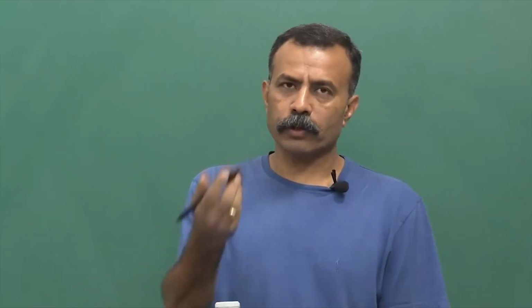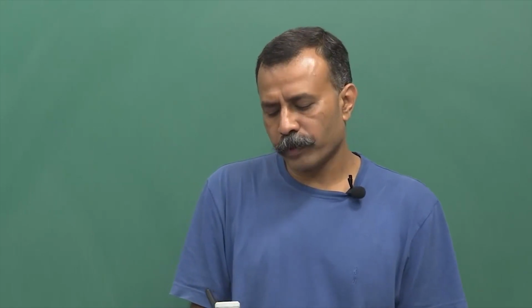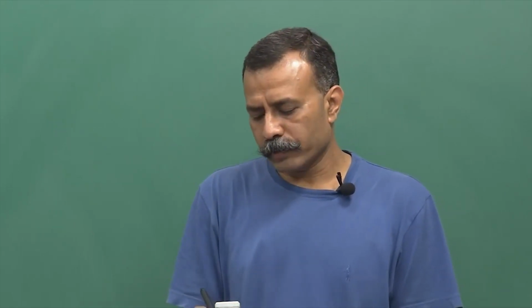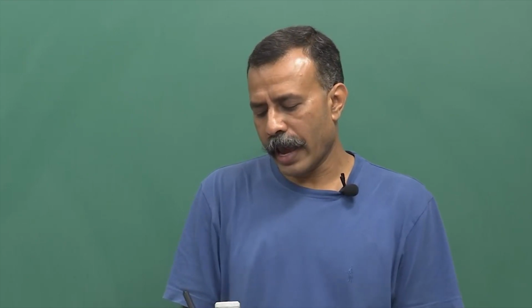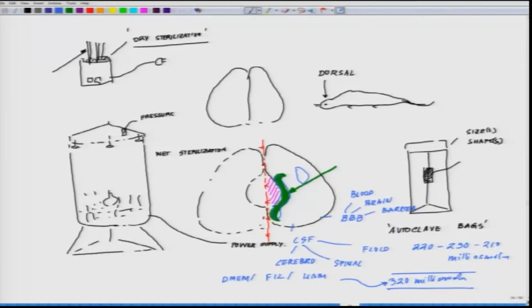For example, once we go to the media, you will realize media like DMEM, F12, HAM, these are different medium names, they all have pretty high osmolarity values, as compared to some of the media developed in recent times, like Neurobasal, exclusively developed by Professor Brewer at Southern Illinois Medical School.